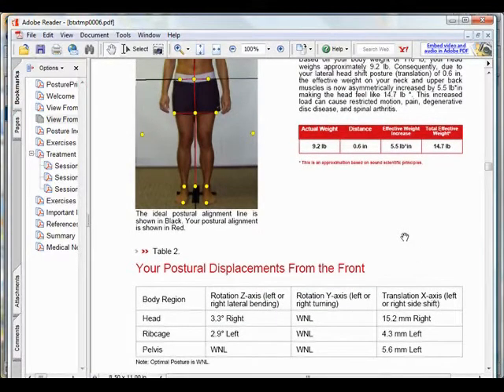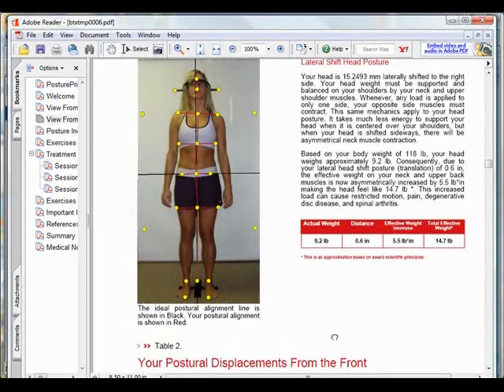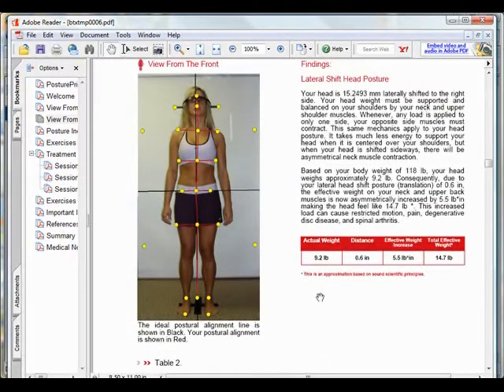No other software is actually translating and discriminating between rotations and translations. A lot of software companies out there like to tout their features, but none of them can actually do this for the average clinician. So this is what differs this as a clinical tool from a screening piece of software. We're able to differentiate the rotations and translations of the patient.